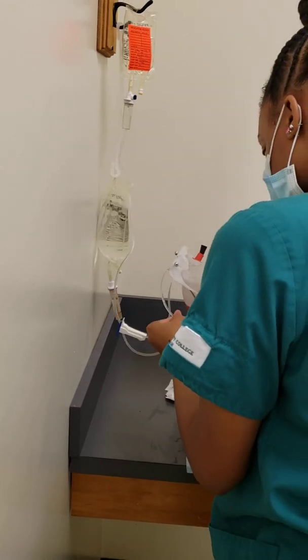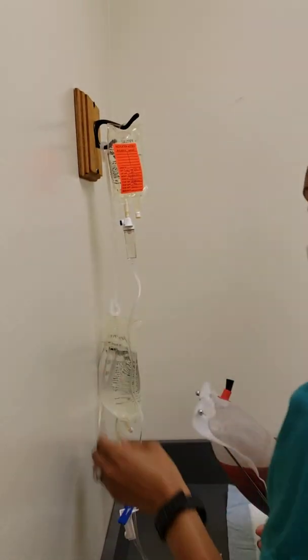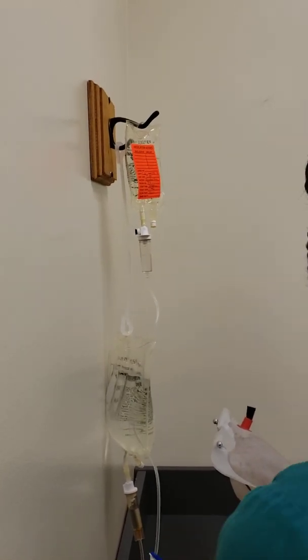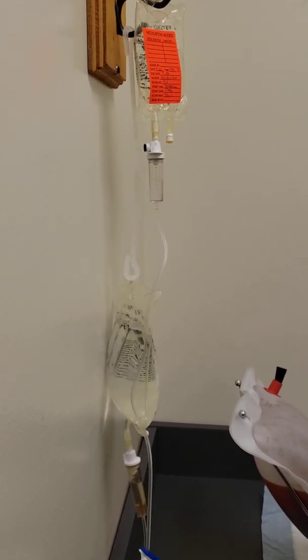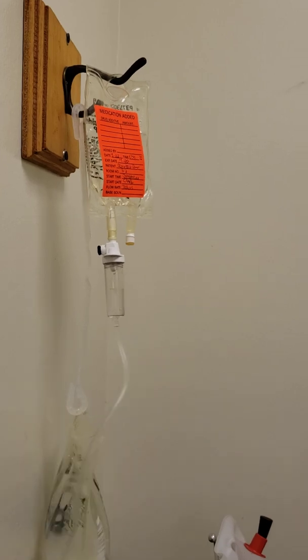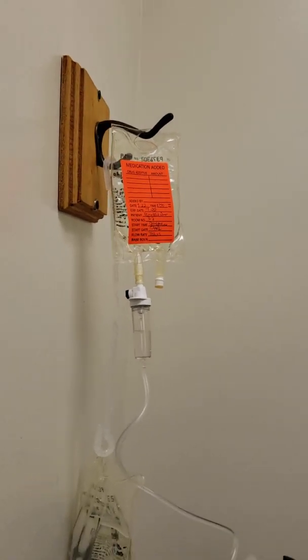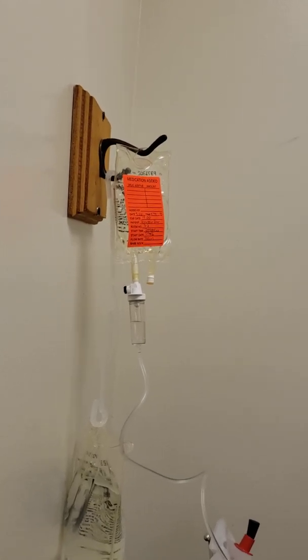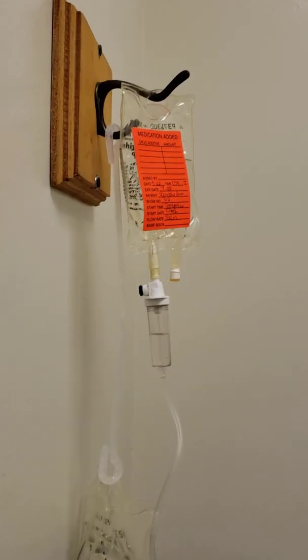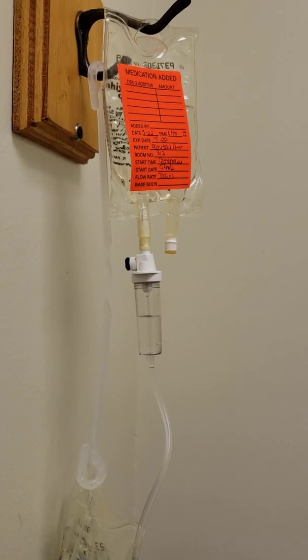Make sure everything's connected. Let's see. Okay, there we go. All right. Okay, so it's flowing properly. Okay, now I'm gonna regulate my drops with my primary. Okay, and I'm gonna count 15 by 15 seconds first, and then we'll count for a minute.